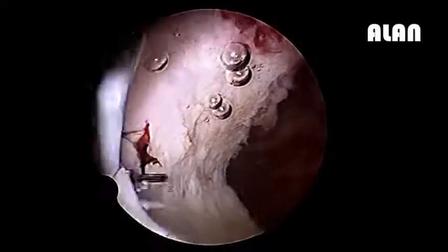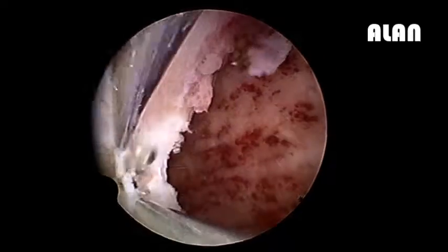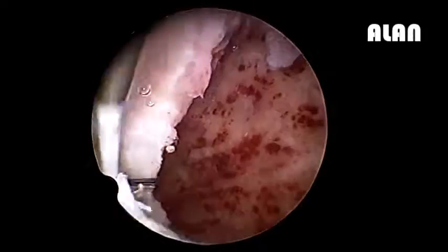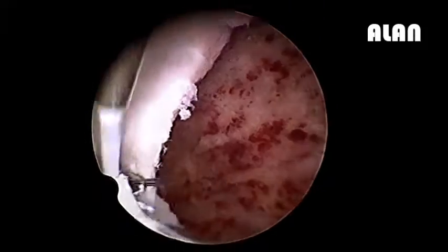Please don't do that, otherwise the patient will have perforation. Now bipolar setting is at 90. I am doing bipolar, I am not using monopolar right now. I have not changed the medium from the previous setting — same medium I am using. And I am cutting more on the left side because the left cavity was bigger.